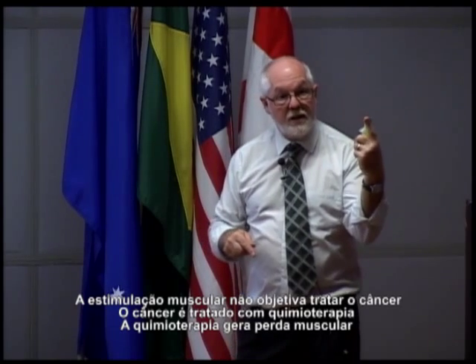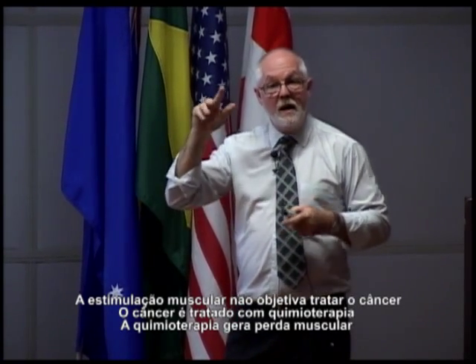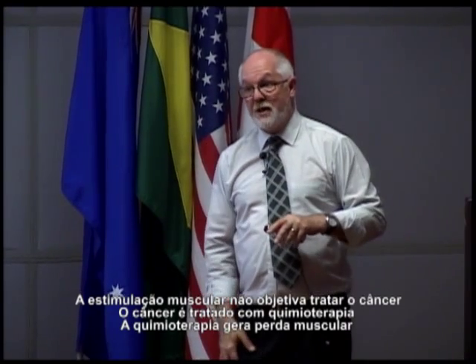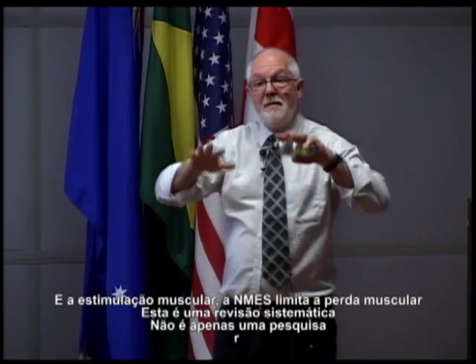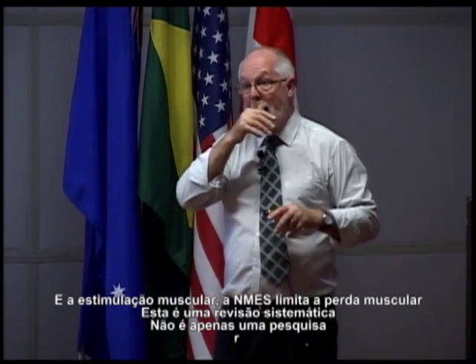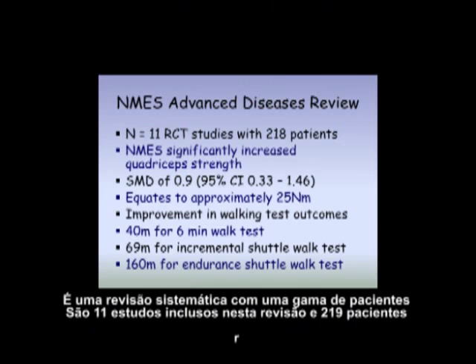The cancer is treated with chemotherapy. The chemotherapy brings about muscle wasting. So the muscle stim, the NMES, is to limit the muscle wasting. And this is a systematic review. It's not one piece of research. This is a systematic review for a range of patients.